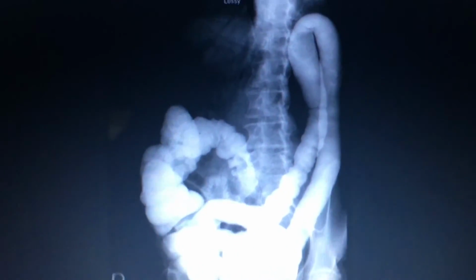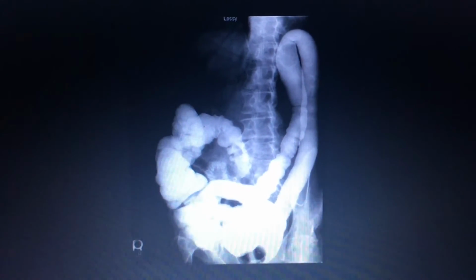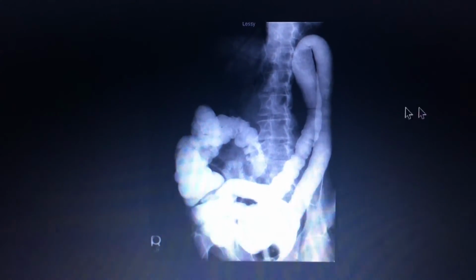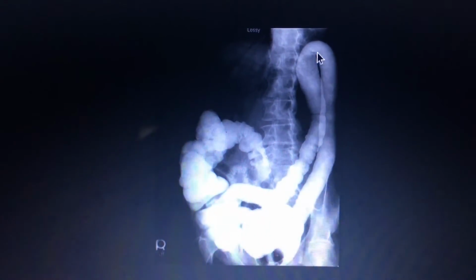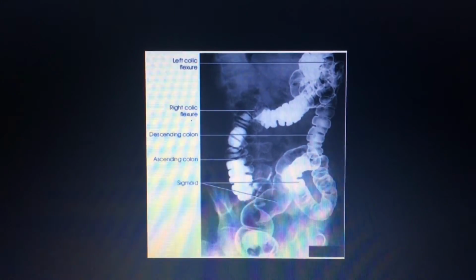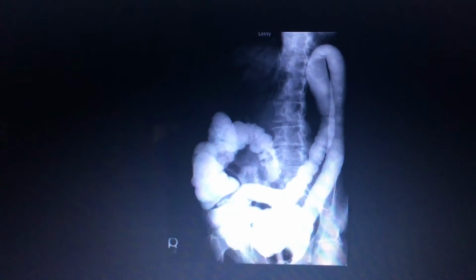This would be the LAO, left anterior oblique. This is going to show the left colic flexure open now. Previously, it's all superimposed. This one is now open, and the right side is now superimposed over itself. You want to make sure you don't get no cutoff on those two. You want to see the whole flexure.